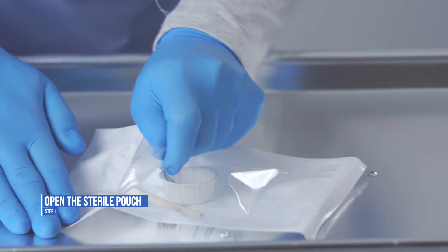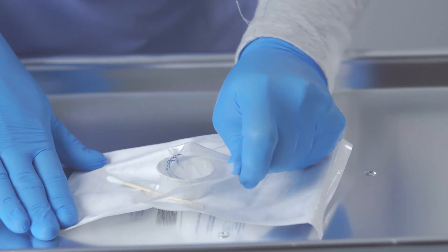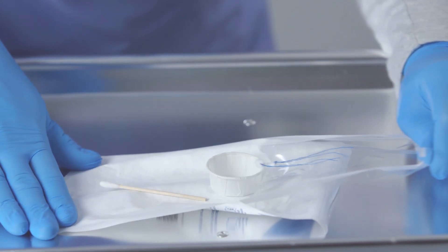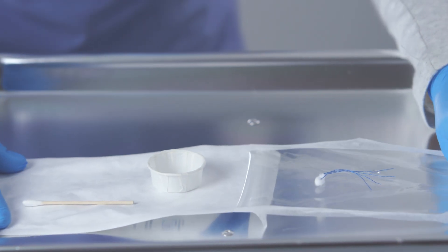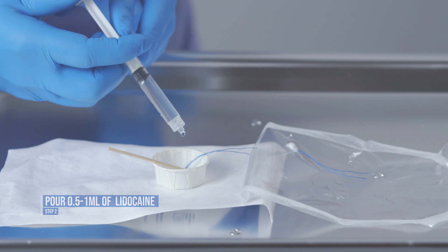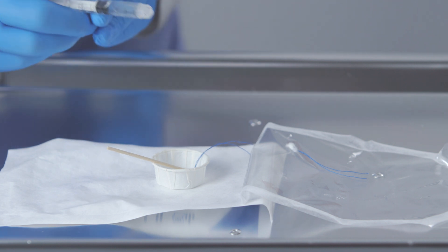The first thing you want to do is open the sterile pouch. Pour a half to one milliliter of lidocaine into the cup, just enough to saturate the pledgets.